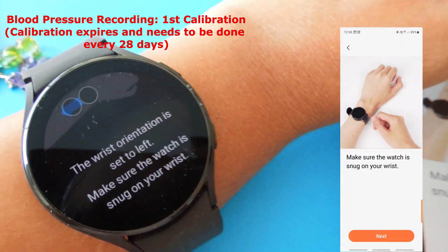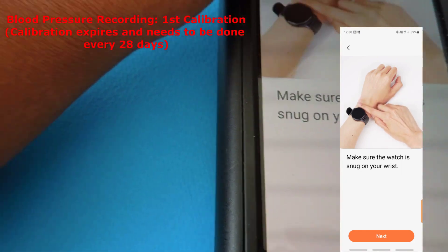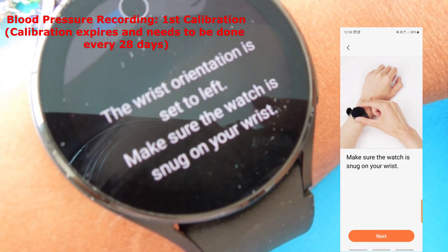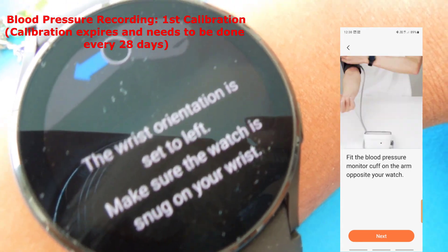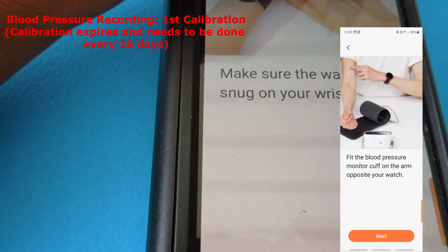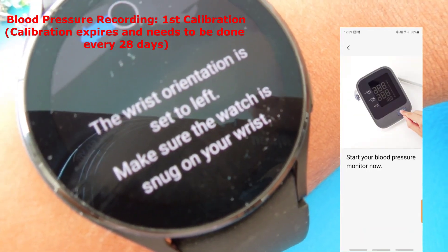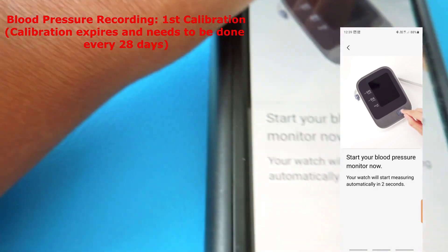On the phone, I've set up as instructed. It shows wrist orientation is set to left and says to make sure the watch is snug on your wrist. I then fit the medical blood pressure monitor cuff to my arm and start the blood pressure monitor. The watch will start measuring automatically.